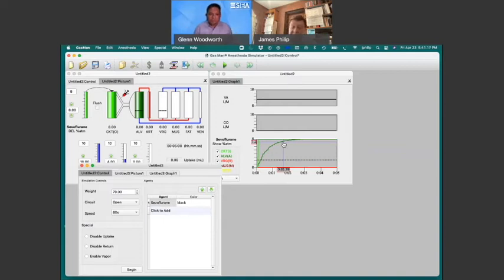Now, with our own residents, we say, we're going to give you a homework assignment. The homework assignment will be to give an anesthetic with isoflurane, with sevoflurane, and with desflurane. Give it for an hour and a half.